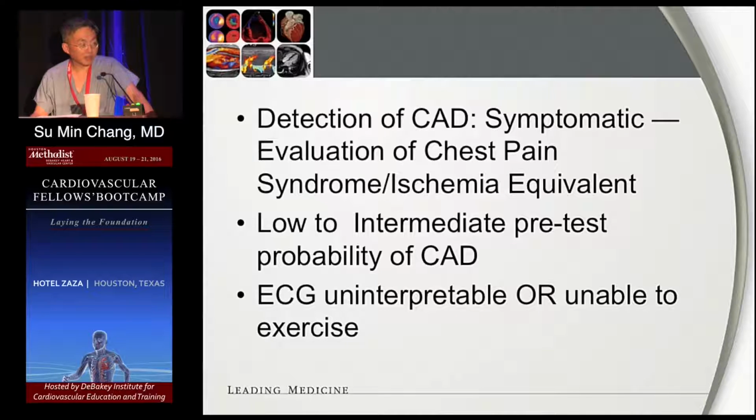The data I'm not going to show you here is overwhelming. If you have a reasonable quality coronary CTA and you don't see any obstructive disease, 99% of the time there is no significant stenosis. So it's the perfect methodology to be the gatekeeper for coronary angiogram in patients that you want to establish presence or absence of disease.